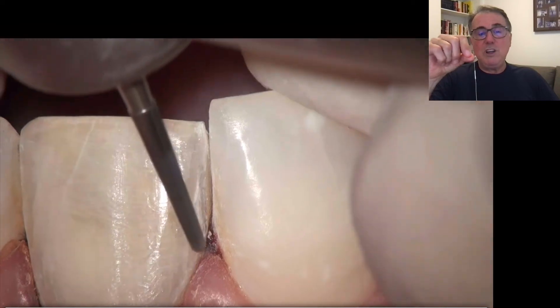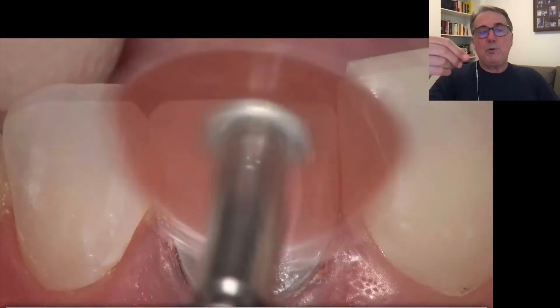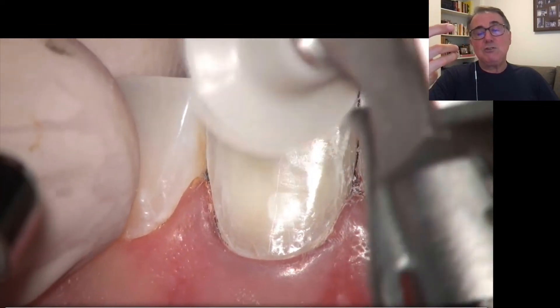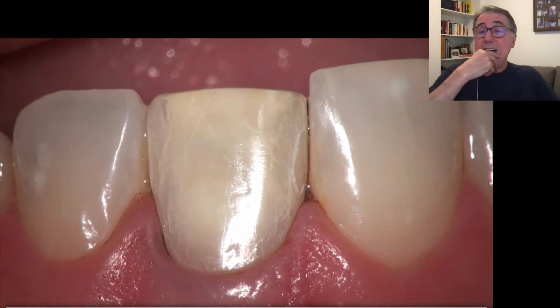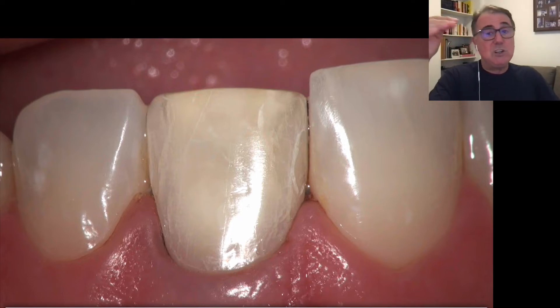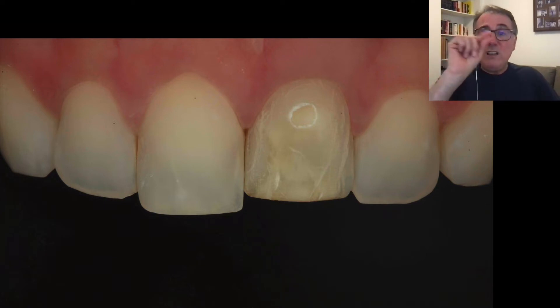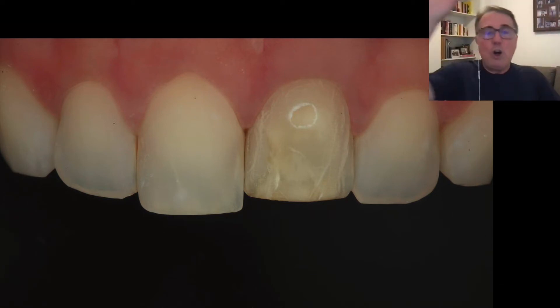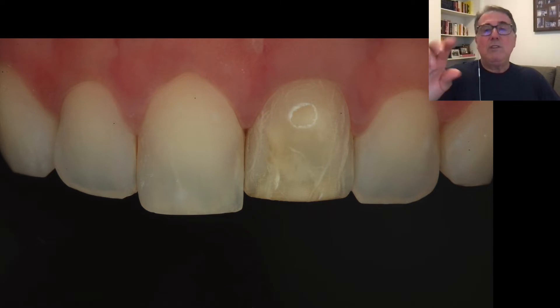As I get close to the other central, I place my metal matrix again. Then with a diamond disc I remove the remaining enamel, and with a finishing disc I remove all sharp angles from the preparation and smooth everything out. At the finishing line — the chamfer — I can use a multi-blade just to smooth it out a bit, then finishing disc and rubber points. The preparation is finished. You can see that only one small spot of dentin was exposed — almost the whole preparation is on enamel, which is better for adhesion.